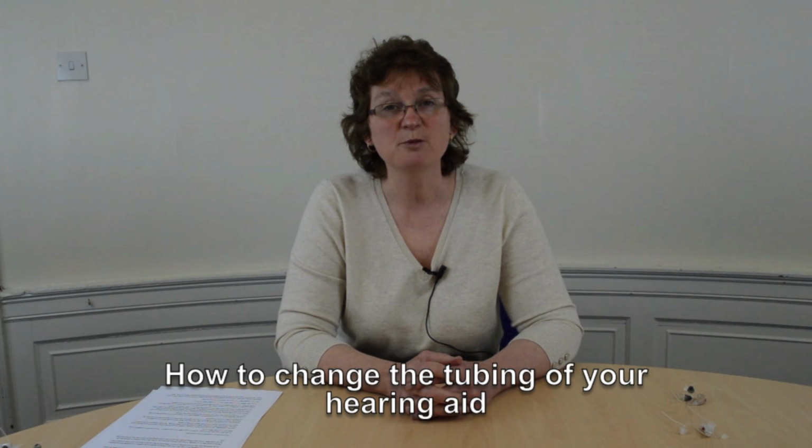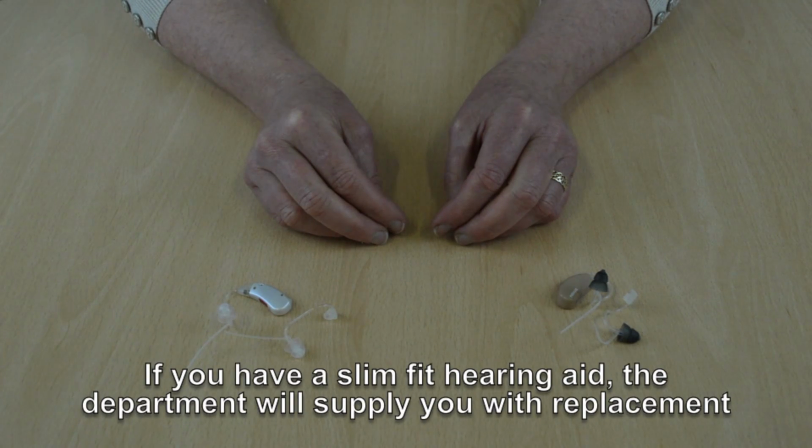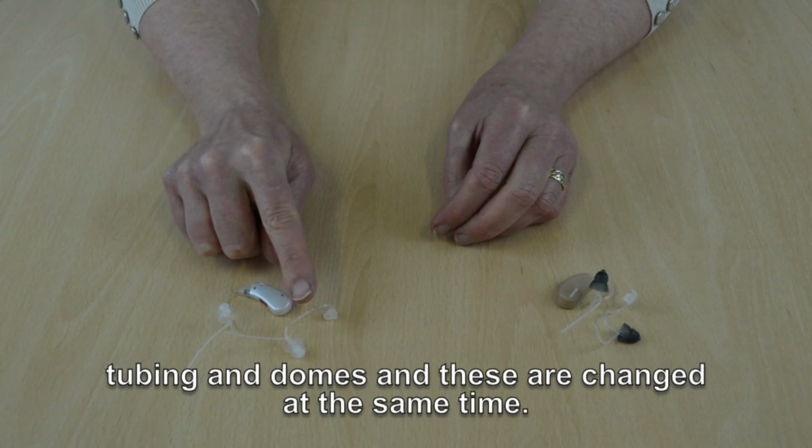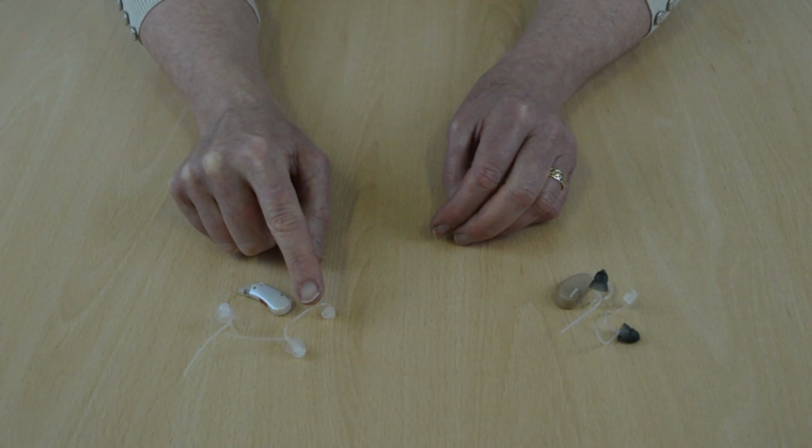How to change the tubing of your hearing aid depends on which type of hearing aid you have. If you have a slim fit hearing aid, the department will supply you with replacement tubing and domes, and they're changed at the same time.